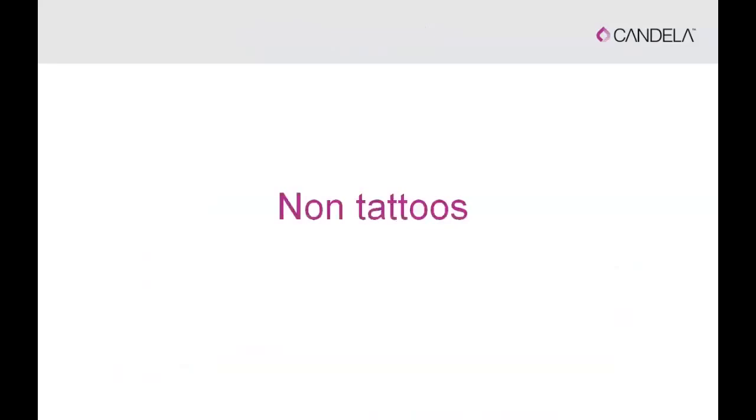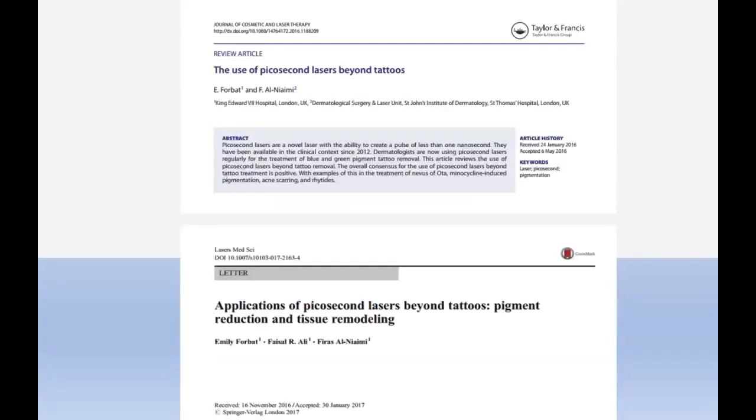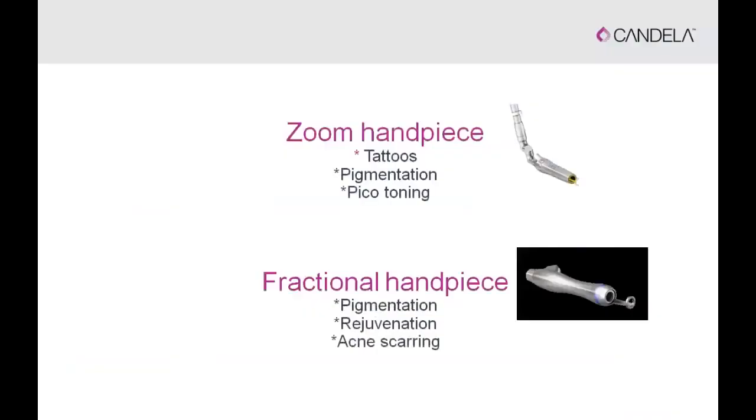So that was covering a bit on the tattoos. However, the main reason we're having this webinar is to concentrate on some of the other uses of the PicoWay, which is pigmentation and tissue remodeling. These are a couple of my papers that I have published in this field of picosecond lasers. The first is on the use of picosecond lasers beyond tattoos, and the other one on the applications in pigment reduction and tissue remodeling.